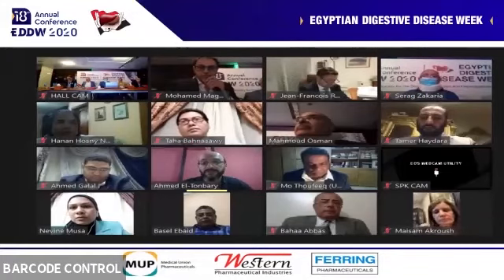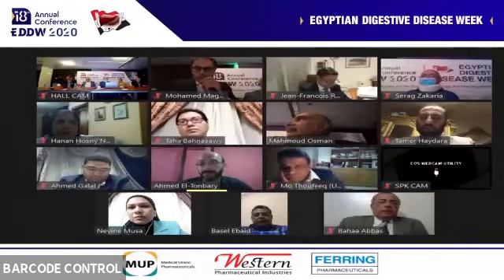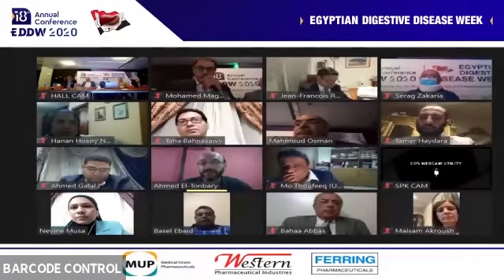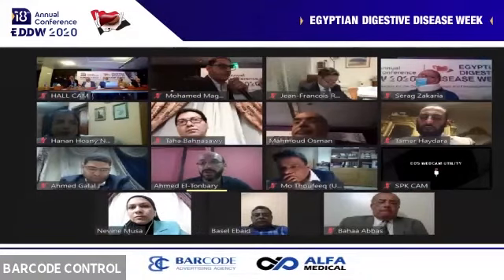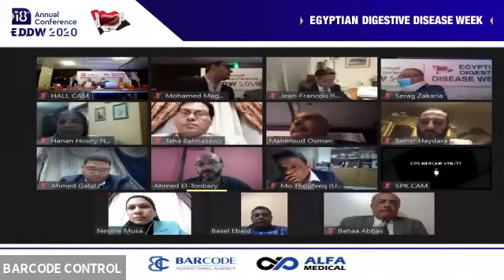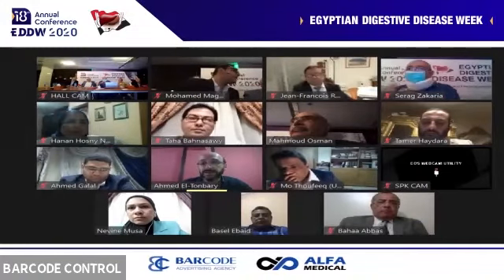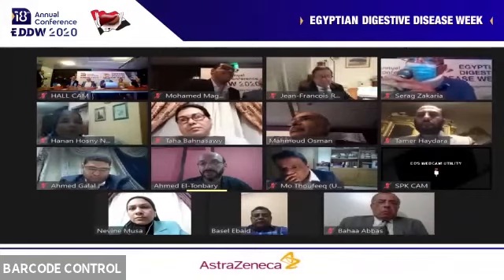We have different methods. First, we use the morphological appearance of the polyp by Paris classification. Paris type 2A, type 2C or type 3, which are a little bit depressed or excavated lesions, are suggestive of submucosal invasion.